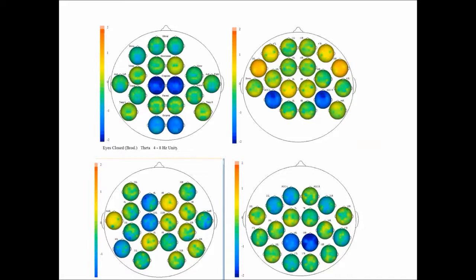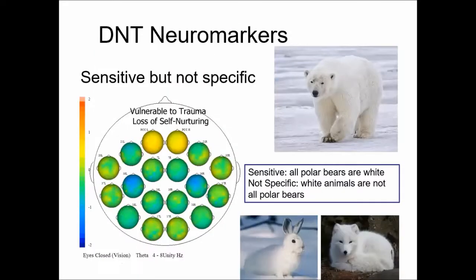So with this individual, you can see the 38s are messed up, and that's usually a sign of the amygdala being too much in control, fight and flight being too much. Get some boundaries. We talk about this in other videos, so I'm not going to go into it much, but just show you that's a nice overview of what's going on with this person. And again, what we do is we target the orange areas, sometimes target the blue, depending if they are a problem. Sometimes blue can be a strength, but orange is almost never a strength. If it's a strength, it's for your professional abilities, but it won't be in your personal life because you're going to be overreacting to the environment. Too much going on there.